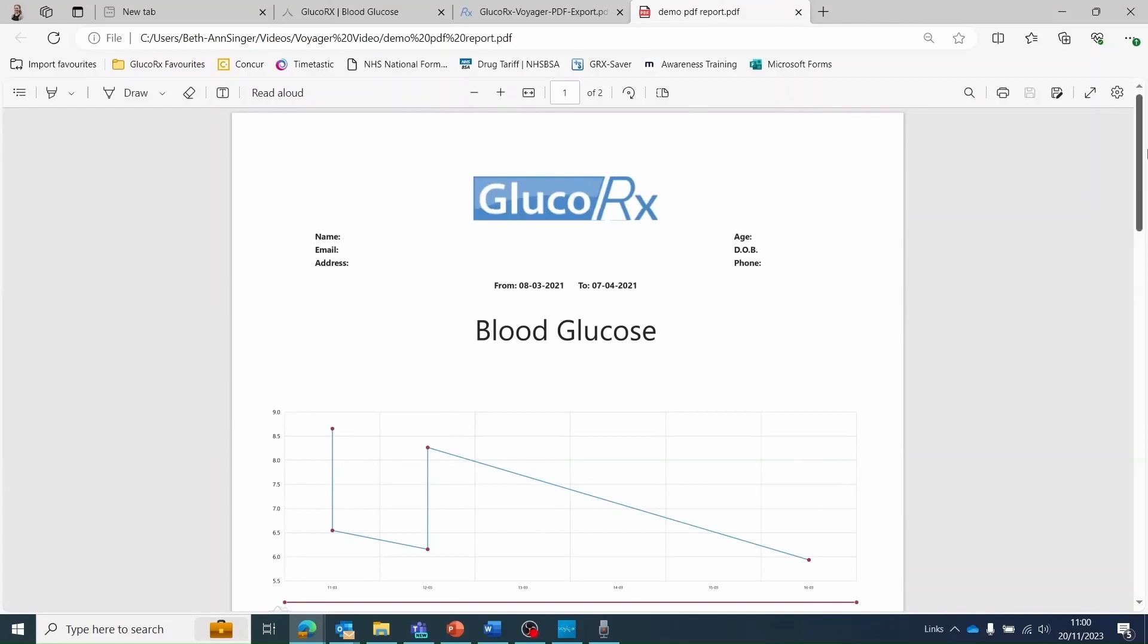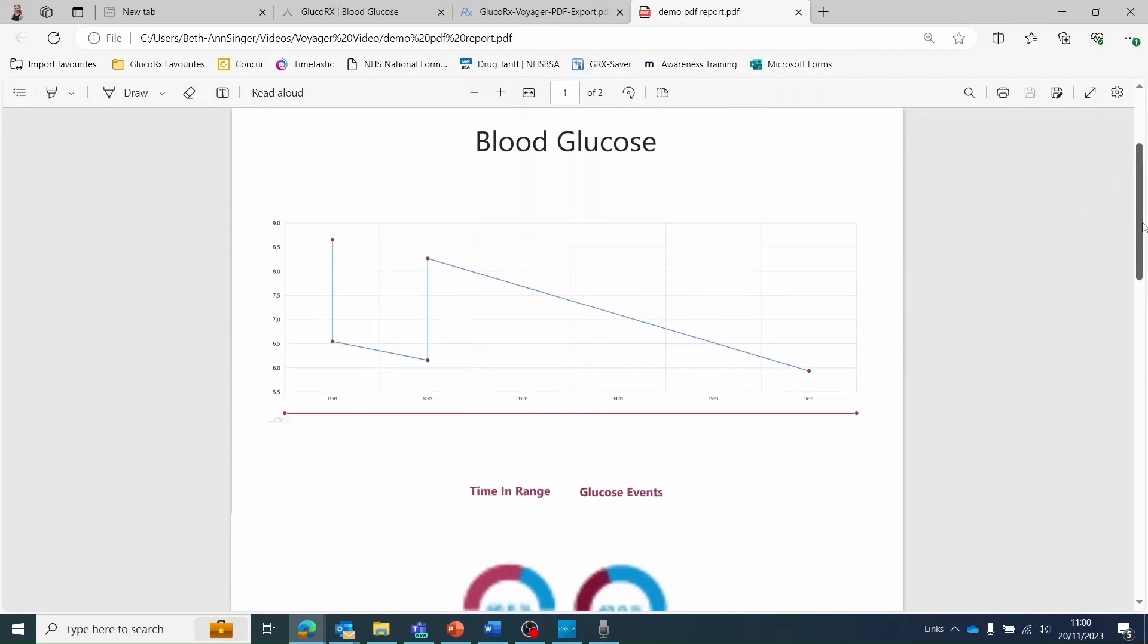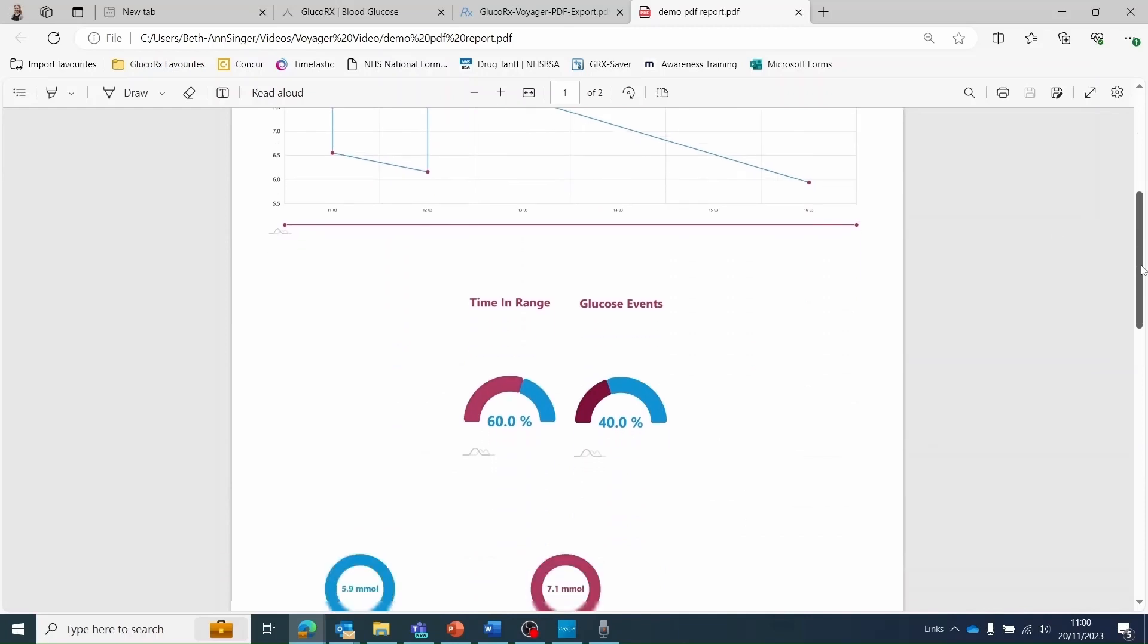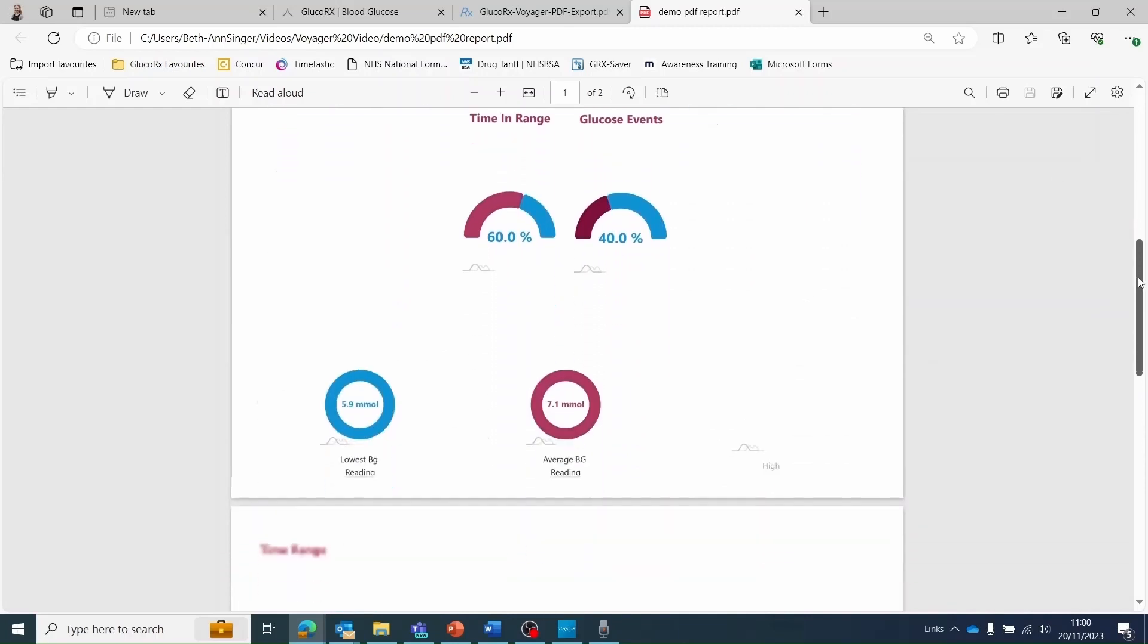Here is an example PDF report of data that has been exported from your GlucoRx Voyager dashboard. Your details assigned to the GlucoRx Voyager account will appear at the top of the report. The date range will also be shown.